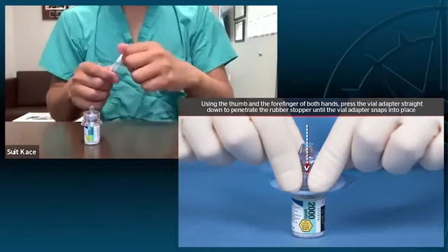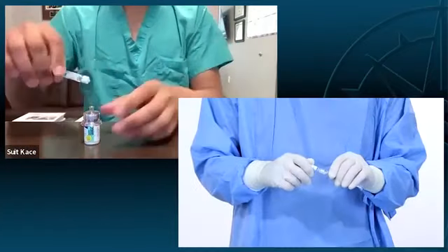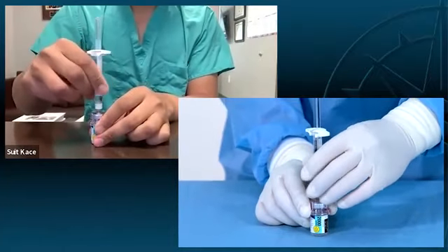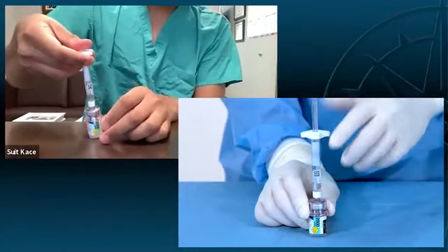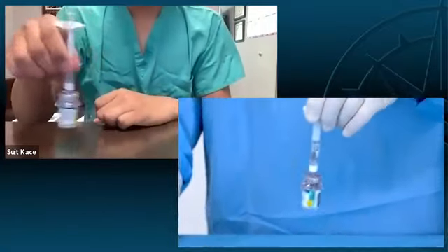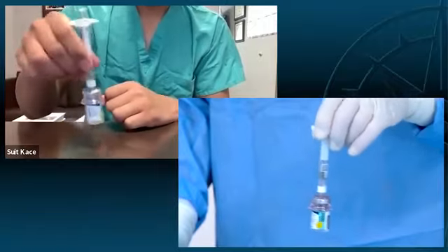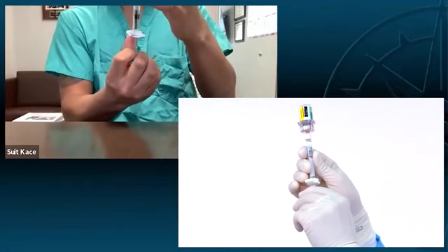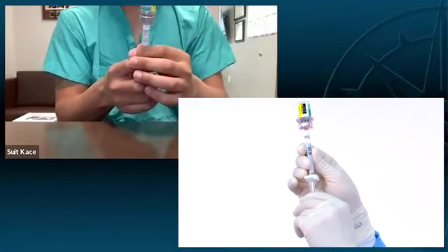and uncap the pre-filled syringe. And it screws right on top. And just introduce that to the powder inside. And like I said, I like to give it a little swirl to prevent bubbles, to make sure you get all the product. And once that's all absorbed, draw it right back up. And this is ready to transfer onto the sterile field.